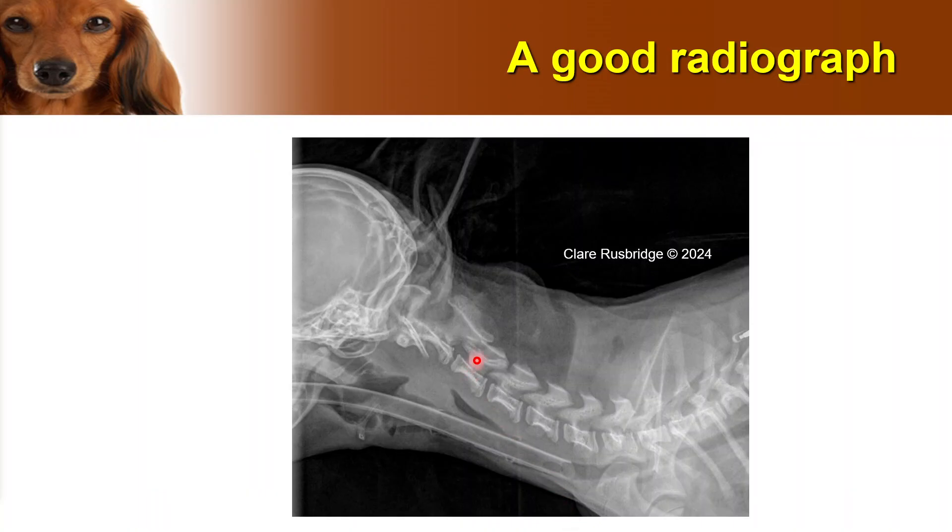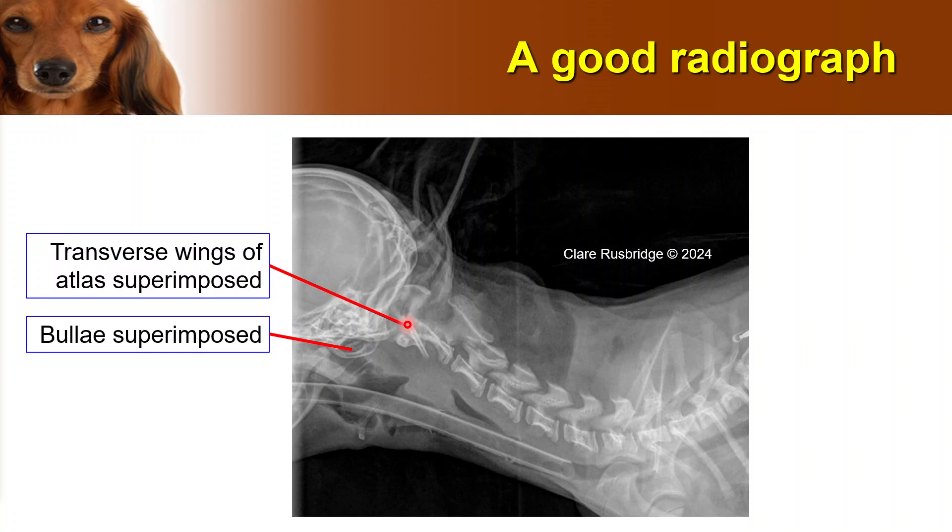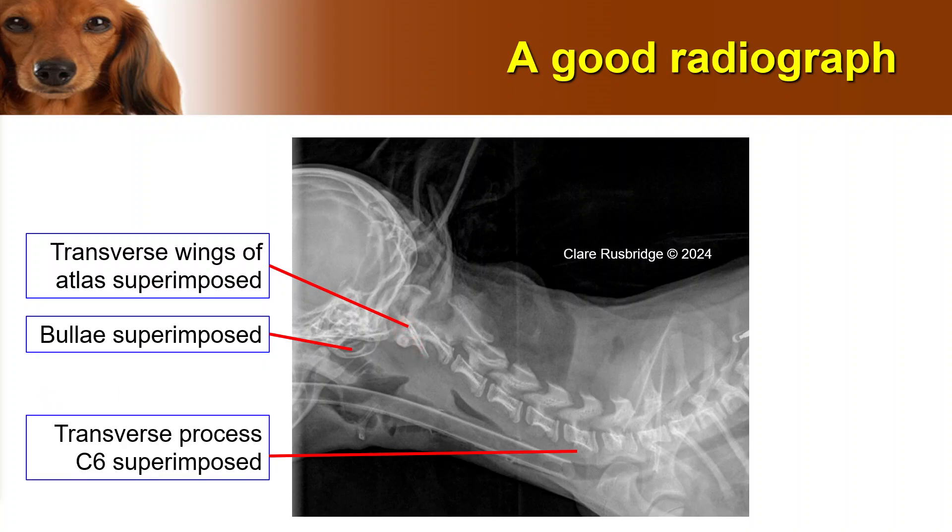What does a good radiograph look like? Here we can see all of the disc spaces nice and clearly — this is an immature animal so you can see the growth plates — and we can see the bullae completely, almost completely, superimposed, so we can tell that the head is straight. We can see that the transverse wings of the atlas are superimposed, and further down we can see the transverse processes of C6 are superimposed, so we know the neck is completely straight. This is a very brachycephalic dog sitting on a very rounded head, so this needed support underneath the neck. And when we do that, we can see that this space is opened up and the animal has a possible atlantoaxial instability.